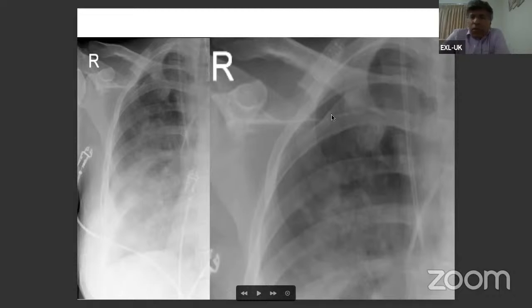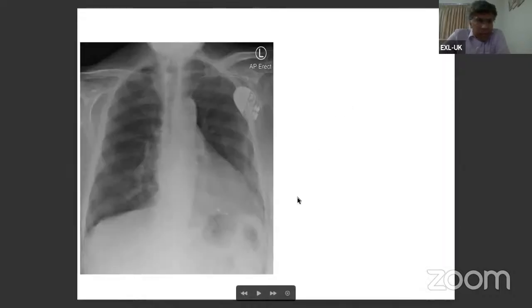You've got to report it. You've got to make sure you're wary of it. That's the most important message. You do need to check X-rays on these patients. However confident you are, you do blind procedures, but that doesn't make you a hero. You have to do X-rays and make sure you're safe. Okay, let's move on. Next slide.